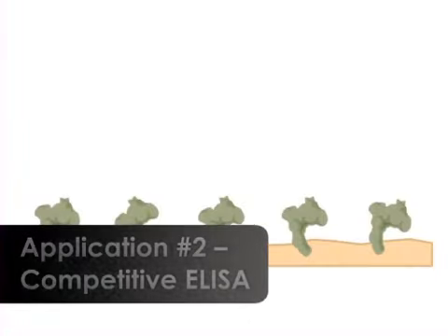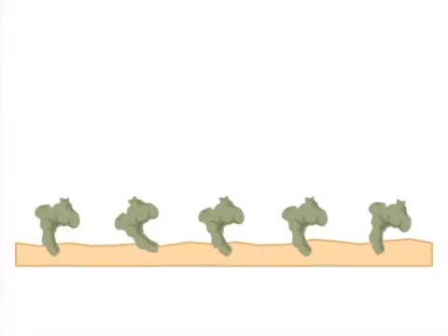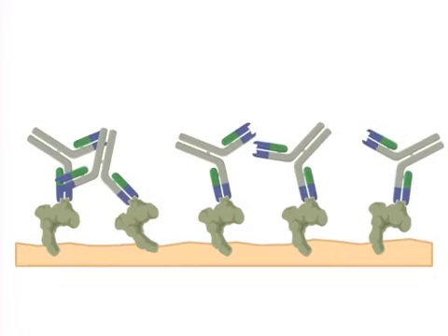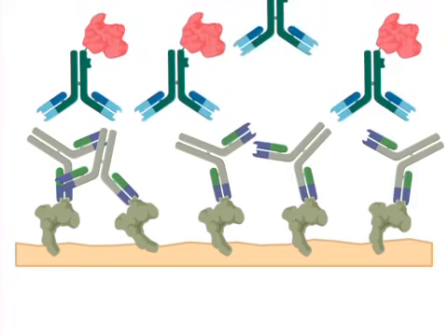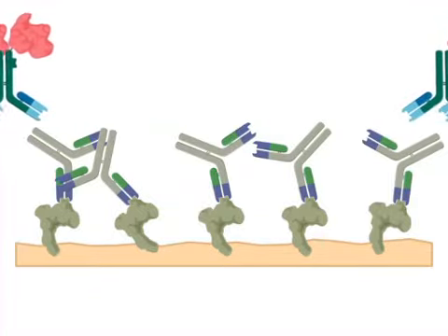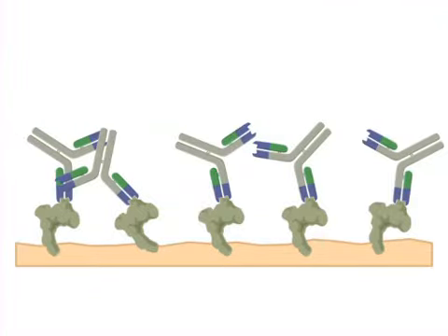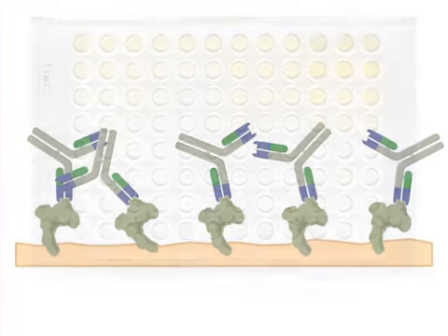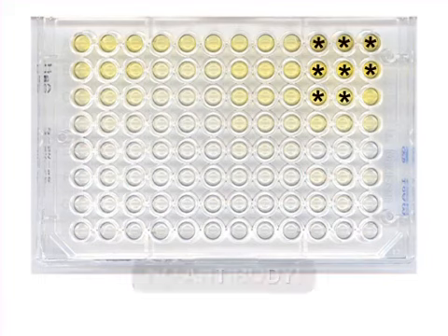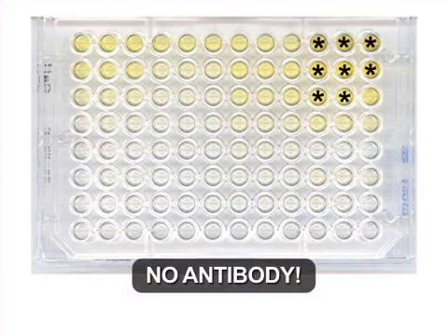Another type of ELISA is the competitive ELISA, which can be used to detect the presence of antibodies. If the antibodies of interest are present in the sample, they will bind to the target protein attached to the bottom of the plate. Later, when enzyme-linked detection antibodies are added to the plate, the enzyme-linked antibodies will find few to no proteins to bind. They will have been outcompeted by the antibodies of interest in the experimental sample. In a competitive ELISA then, the colored wells indicate the samples that actually do not contain the antibody of interest.